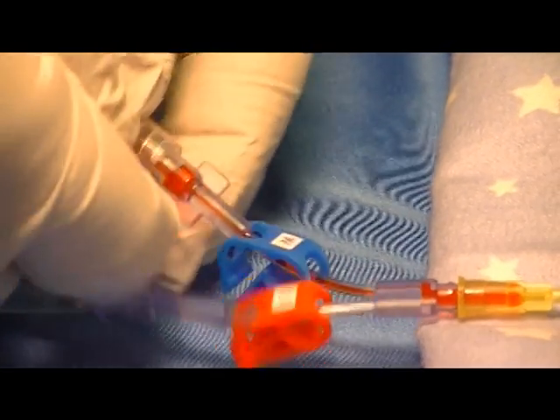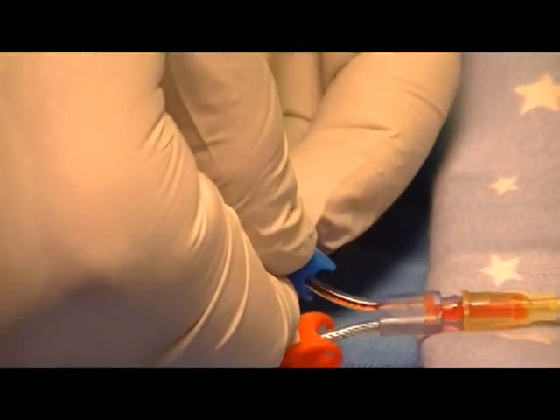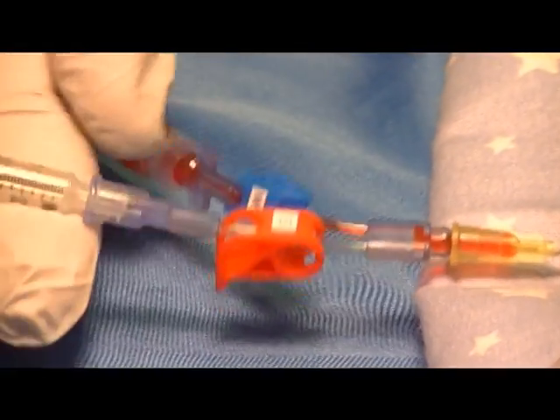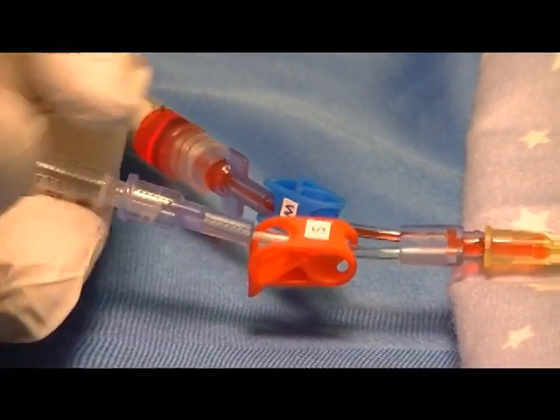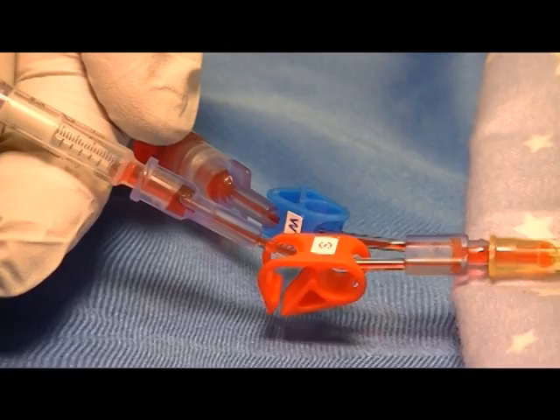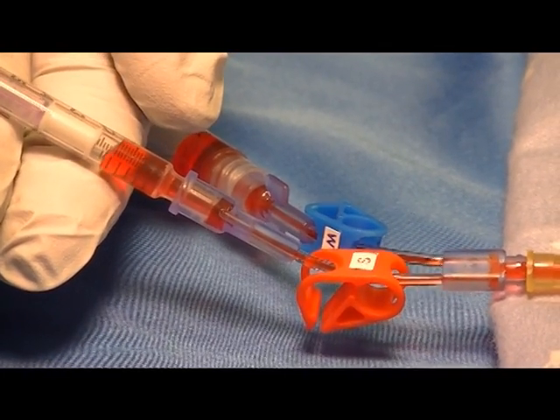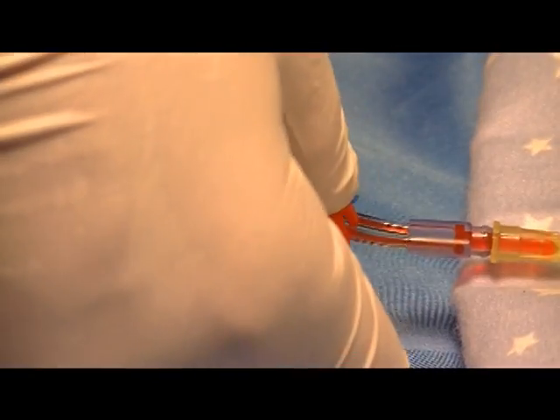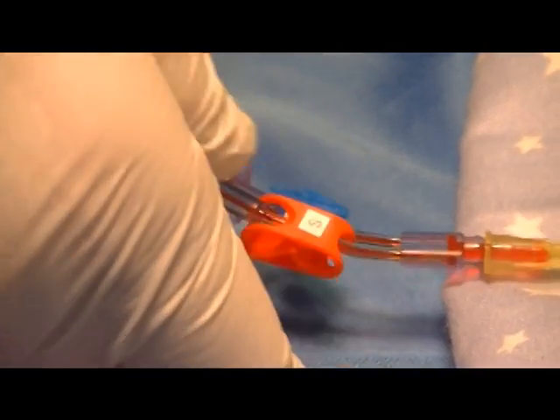Once you have drawn the 0.5 of waste, you would then reclamp and go to the sample side and unclamp, and allow the sample to fill to the preset volume. Then re-clamp the sample side.